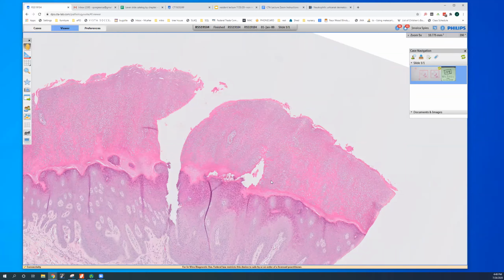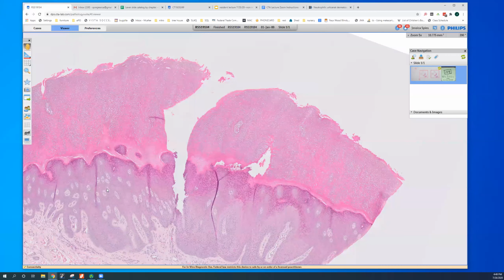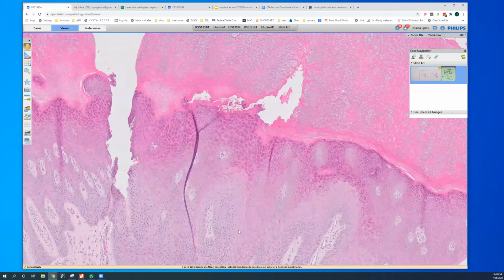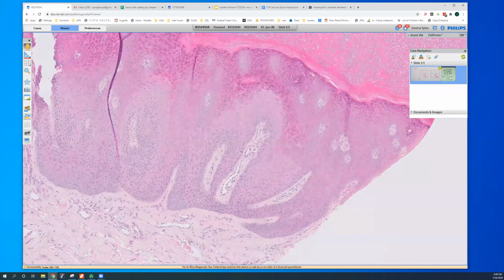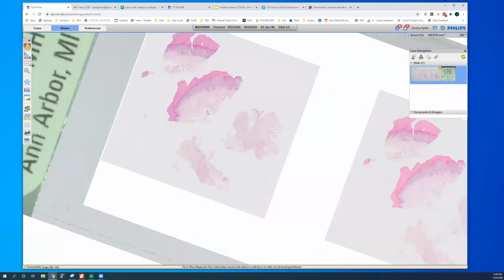We've got massive hyperkeratosis made of compact orthokeratosis, this really marked hypergranulosis, marked epidermal hyperplasia. We've got the beautiful vertically oriented vessels in the papillae. Yeah, exactly. Okay, but that's not what this case is, although it's got a component of LSC.